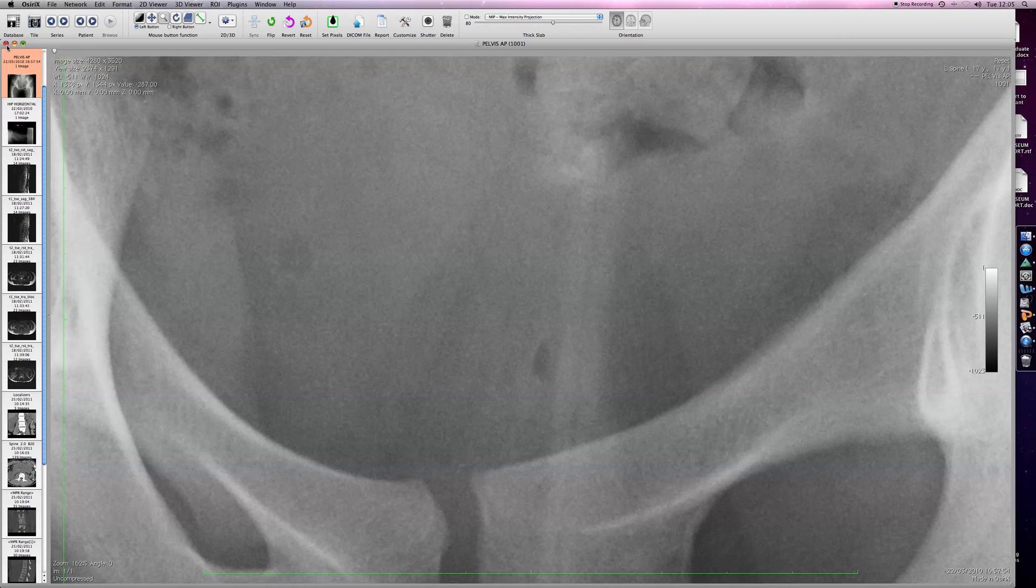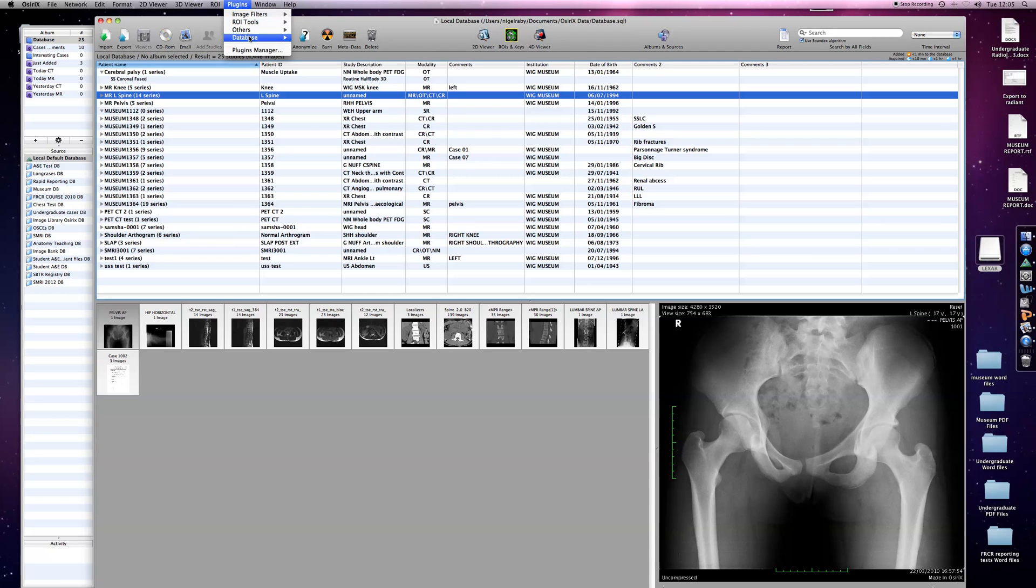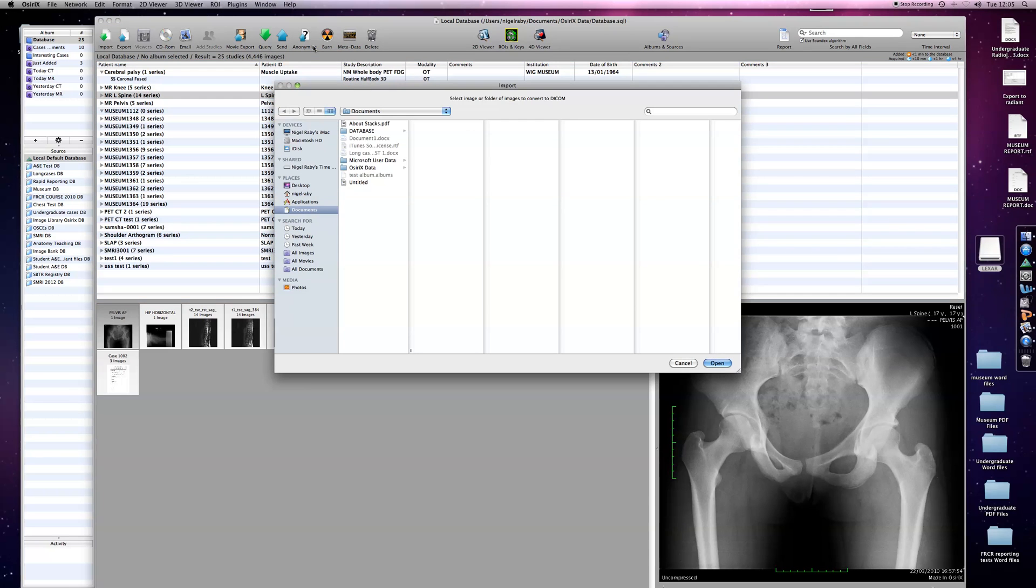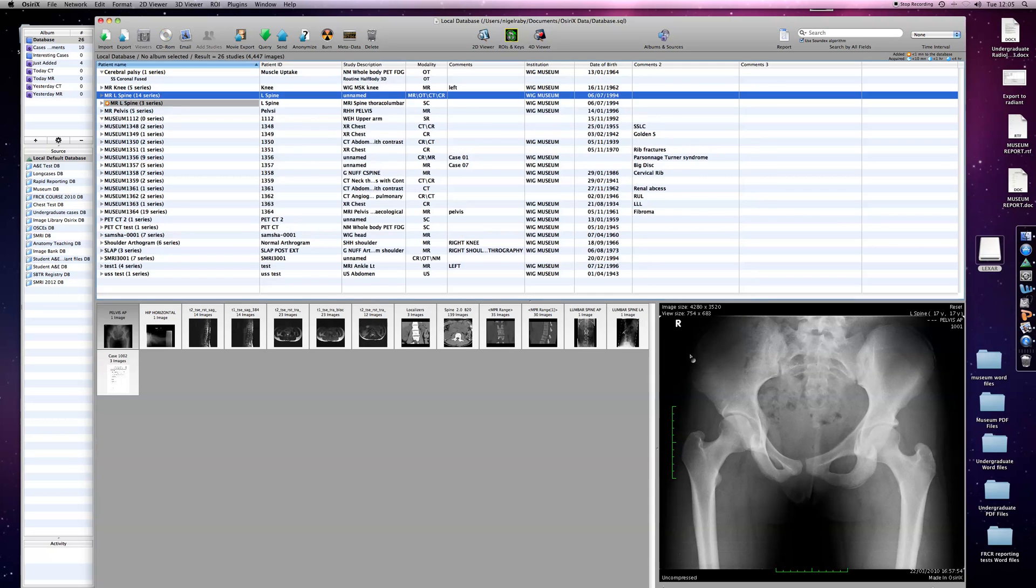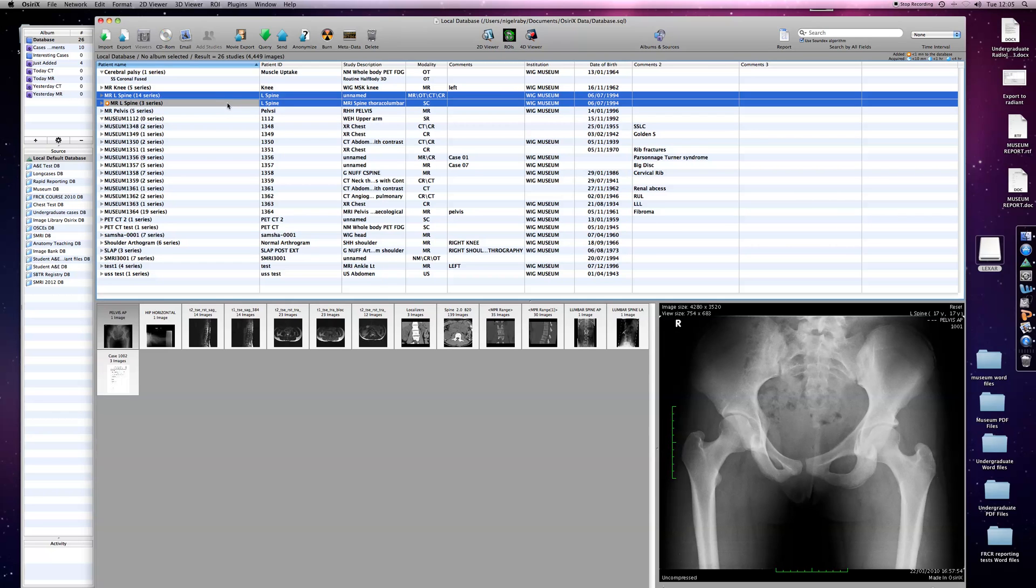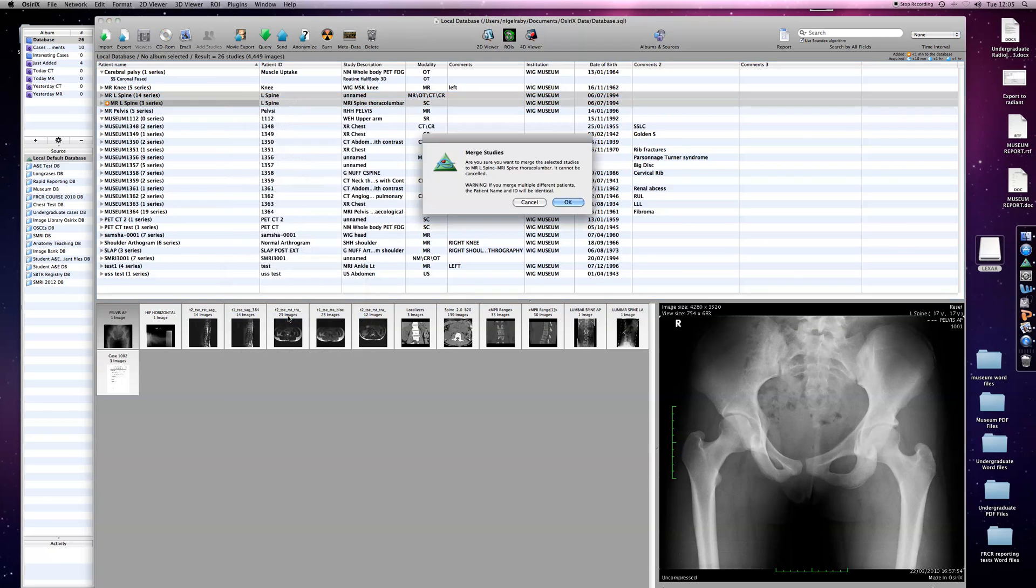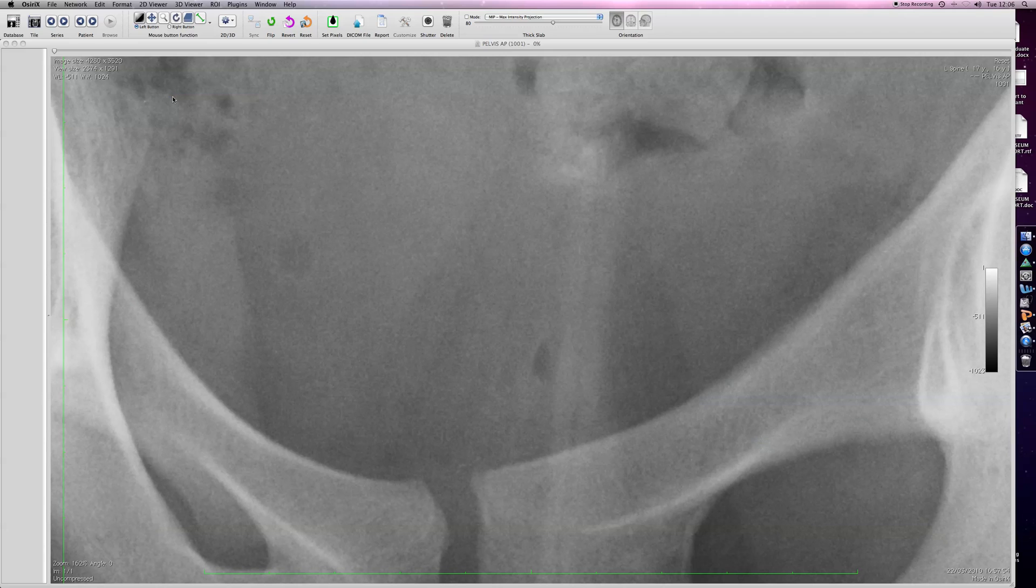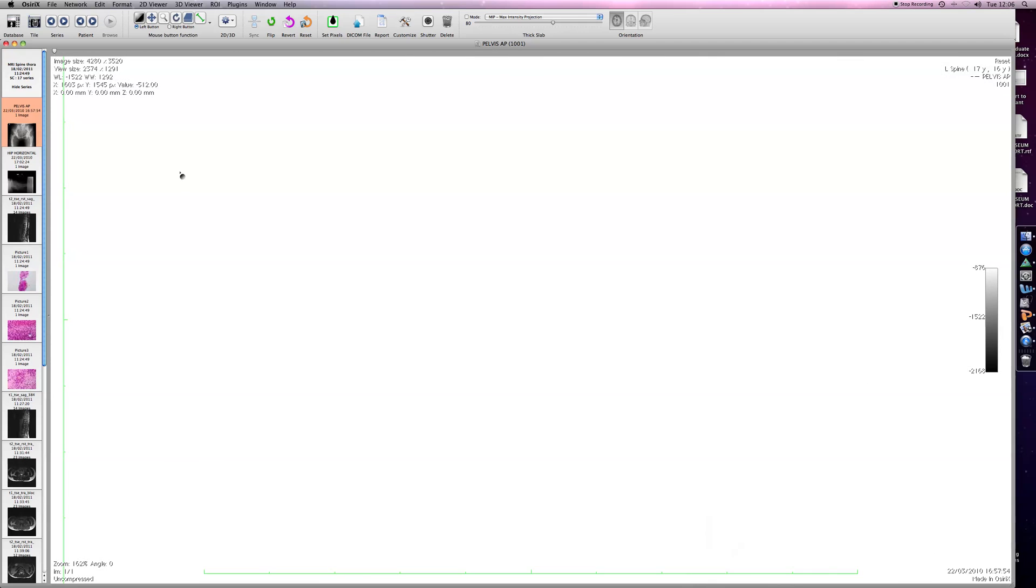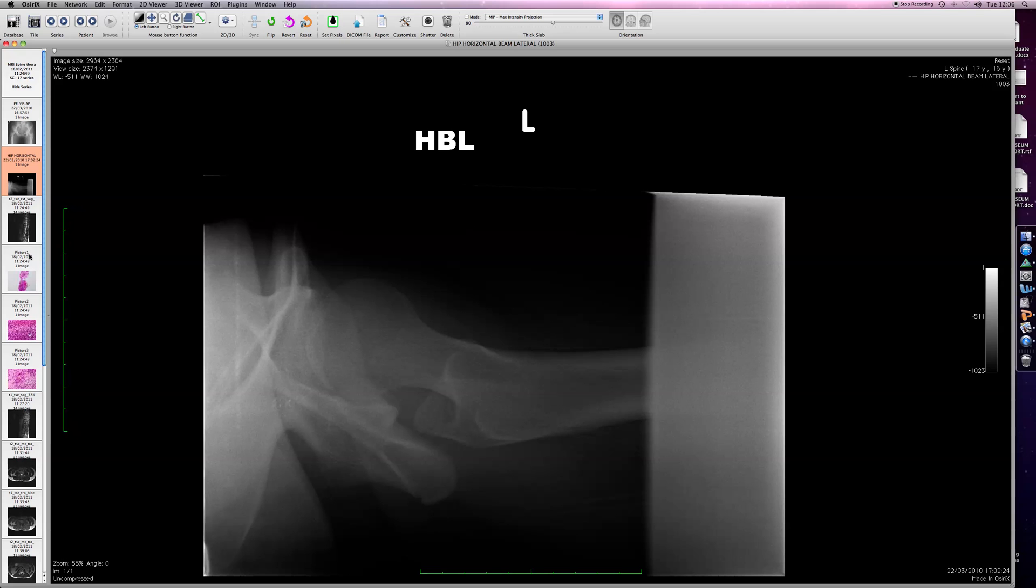We can do the same: highlight the case, go to Plugins, go to Database. This time let's take some JPEGs—JPEG to DICOM. Navigate to the pen drive. I'll highlight these pictures—these are histology pictures. I can take all three together, click on Open. Same thing again: the three series has been put in under the case. Left-click, Shift highlights, right-click allows us to scroll to Merge, Merge Studies, okay. You can see we now have some histology.